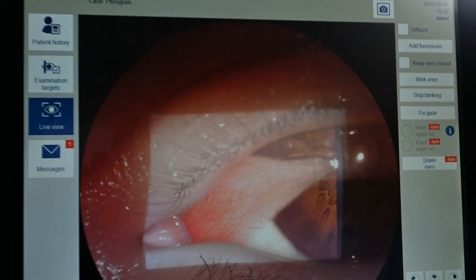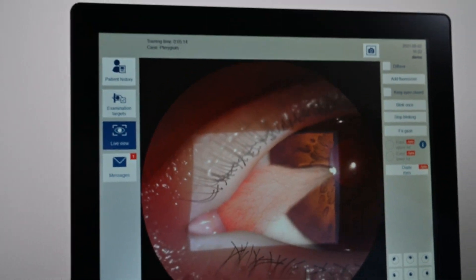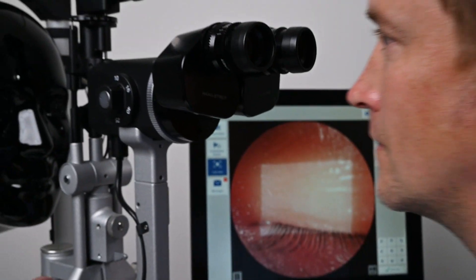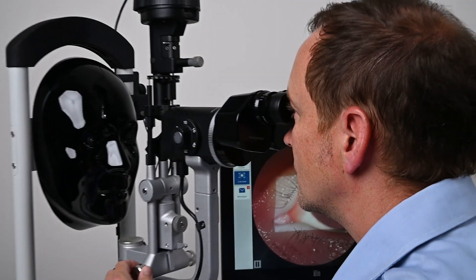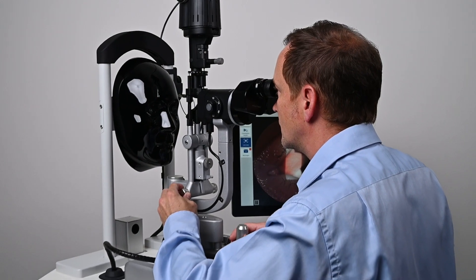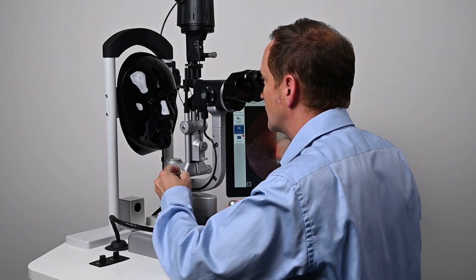Training with IC slit lamp allows for a standardized learning experience and ensures that all students reach the same level of clinical proficiency.